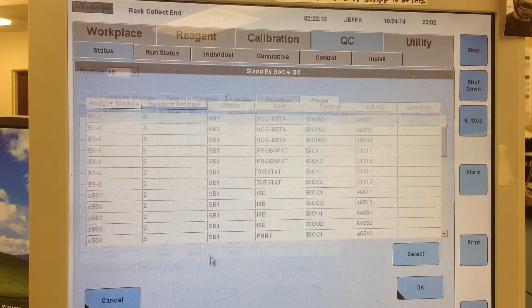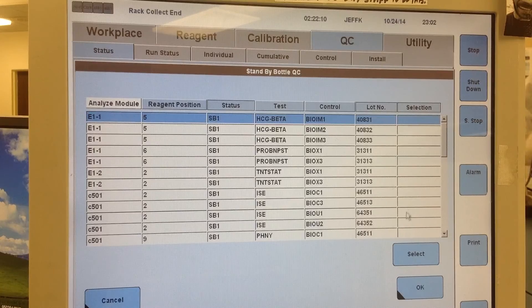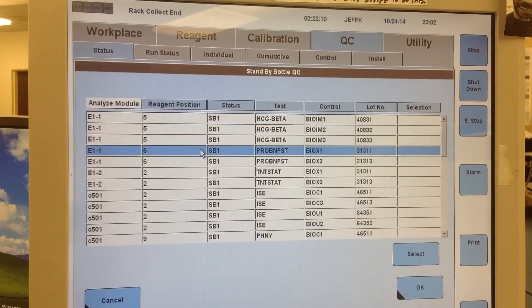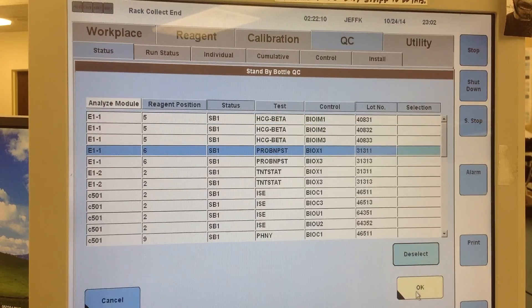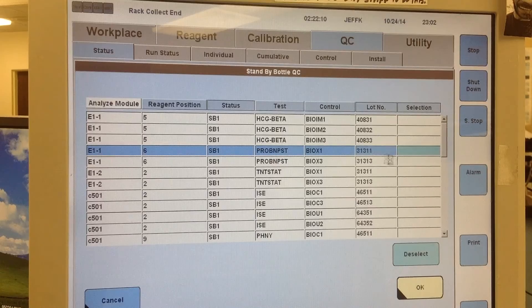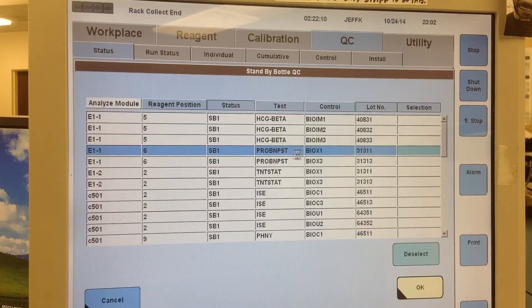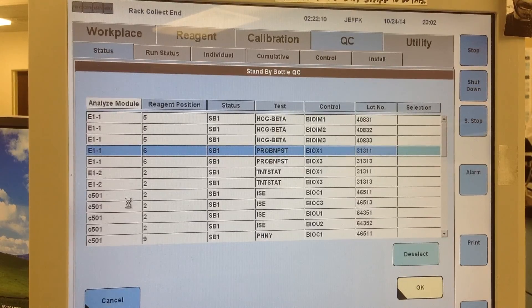Now I can go back there and see that everything is unordered, and then if I want to, I can go ahead and select, and then hit OK to save it, order the Pro BNP on my standby.